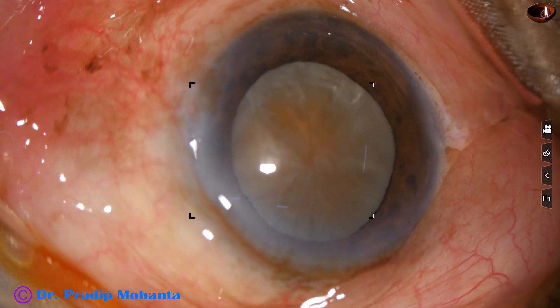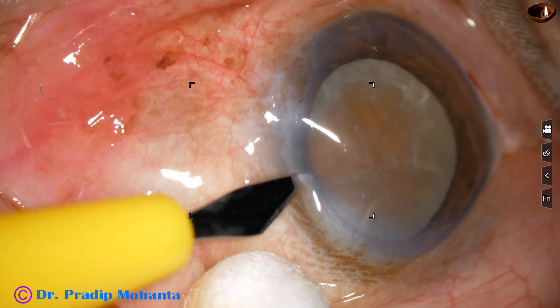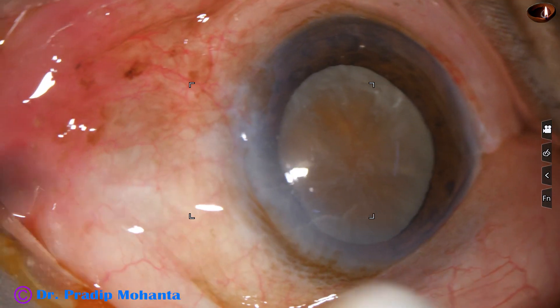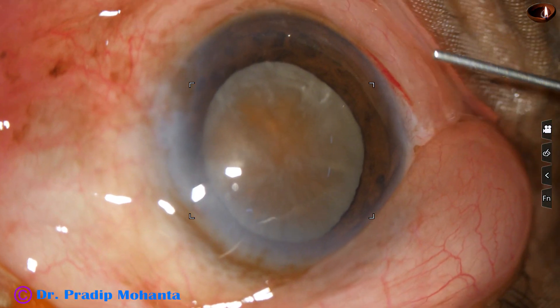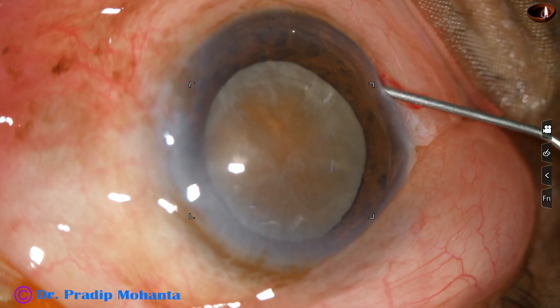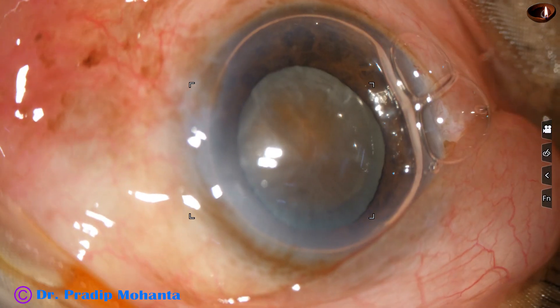The incisions are made — the main incision and two side ports. And then I am going to stain the anterior capsule with trypan blue dye. I usually do this underneath an air bubble.